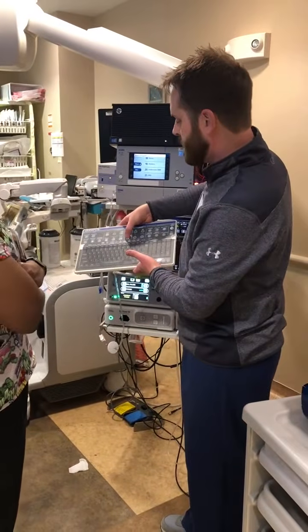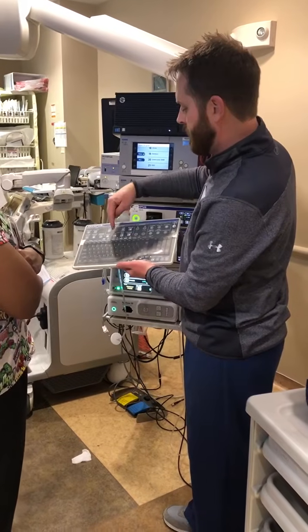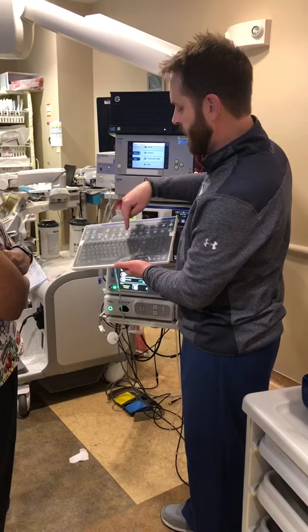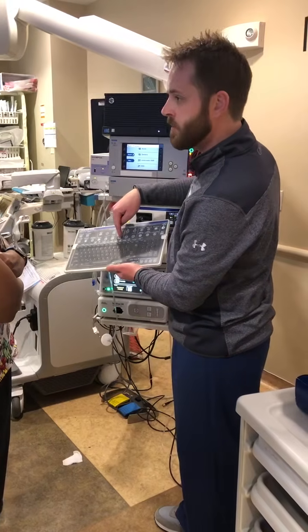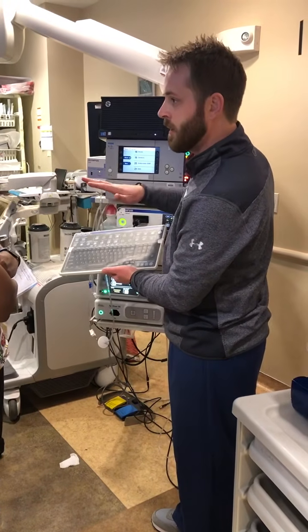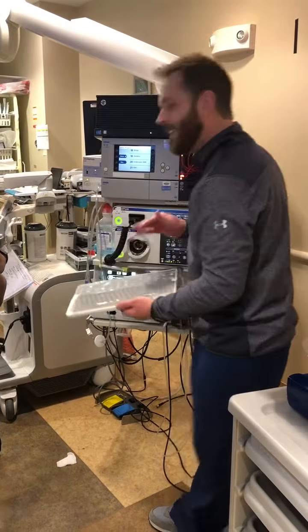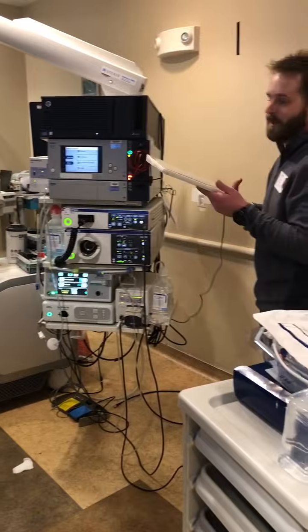Okay. But basically, if you understand that you turn on spy, pick how you want to look at it, and pick if you're looking at EUS or Spyglass, you're going to be the rock star tech with Spyglass. And I know it seems like not a lot, but it's a big deal.